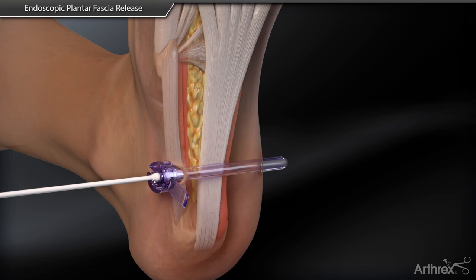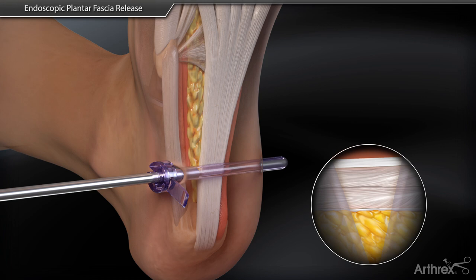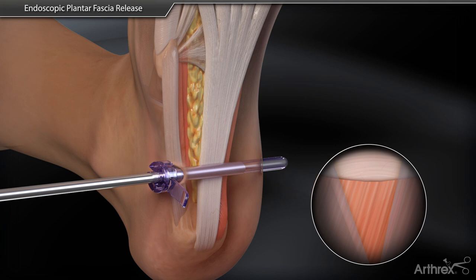Cotton swabs are inserted from lateral to medial through the cannula, clearing soft tissue debris. A 4.0 mm 30-degree arthroscope is inserted laterally and inspection of the fascia is performed to identify the separation between the central and lateral band of the fascia.